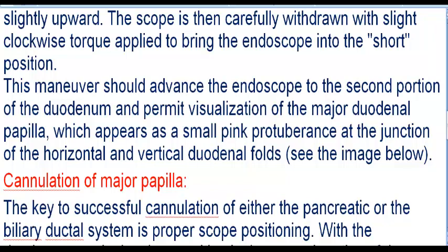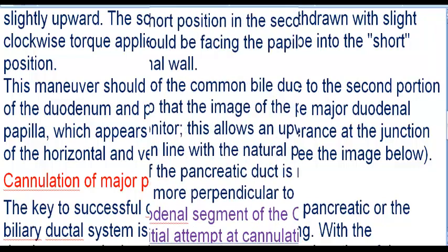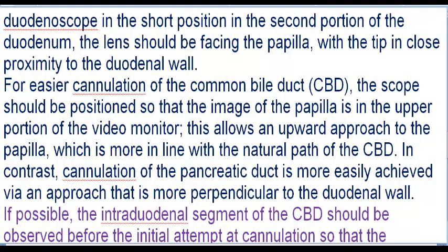This maneuver should advance the endoscope to the second portion of the duodenum and permit visualization of the major duodenal papilla, which appears as a small pink protuberance at the junction of the horizontal and vertical duodenal folds, see the image below. Cannulation of major papilla. The key to successful cannulation of either the pancreatic or the biliary ductal system is proper scope positioning. With the duodenoscope in the short position in the second portion of the duodenum, the lens should be facing the papilla, with the tip in close proximity to the duodenal wall.